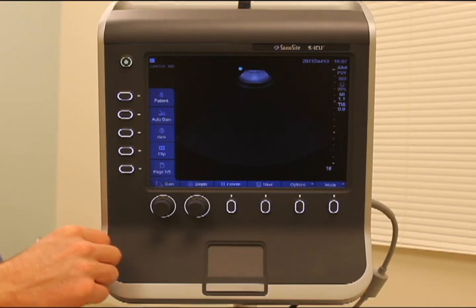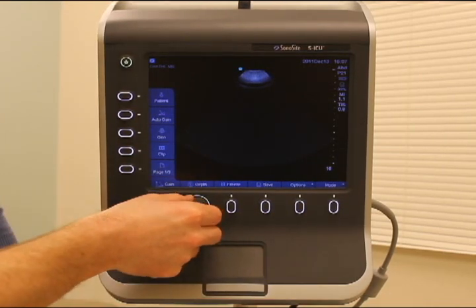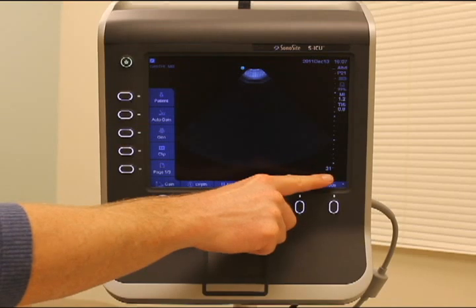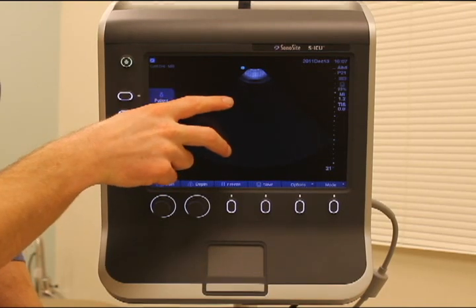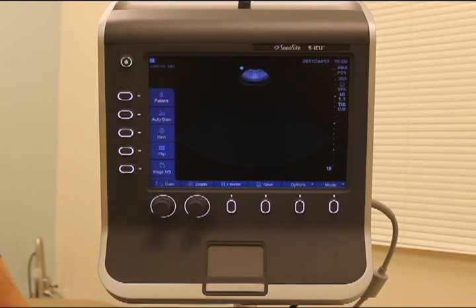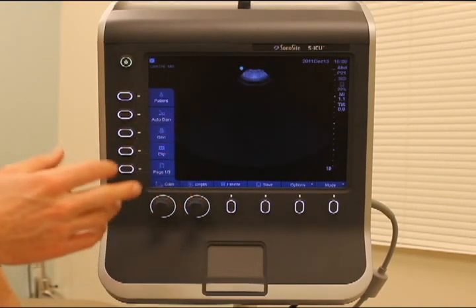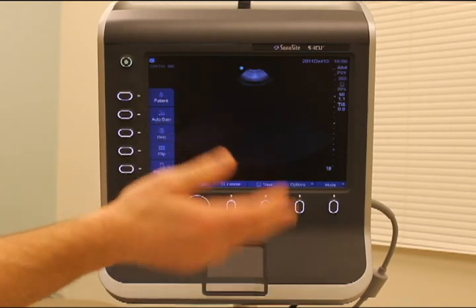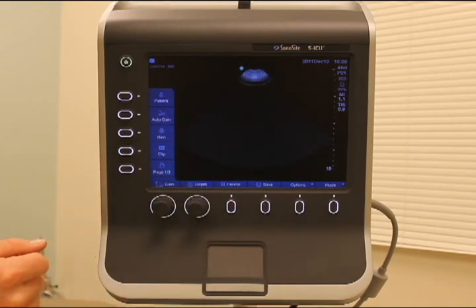The other button you need to know really well is depth — you'll probably need to adjust this for every patient. Rotating it gives you more depth, and the numbers in the corner are set to centimeters. You want to make sure that what you're most interested in falls essentially in the middle of the screen for the best resolution, so adjust your depth accordingly. You should also be familiar with the freeze frame button — if you're looking at something and want to take a measurement, hit freeze — and the save button, if you want to save a loop to review later. With just these few buttons you should be able to handle almost everything you need.